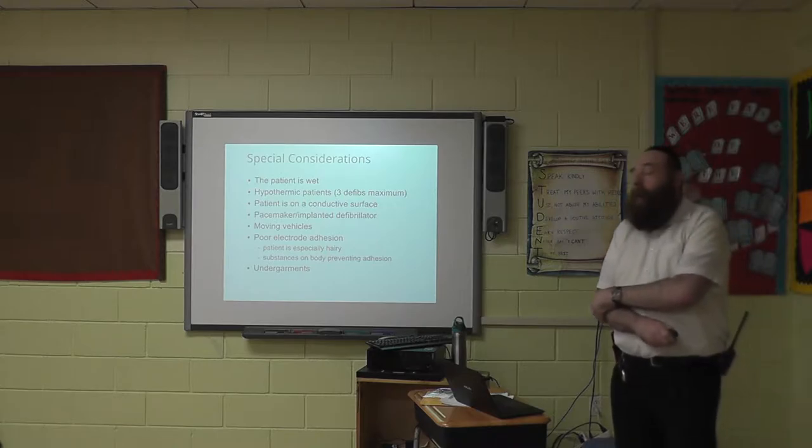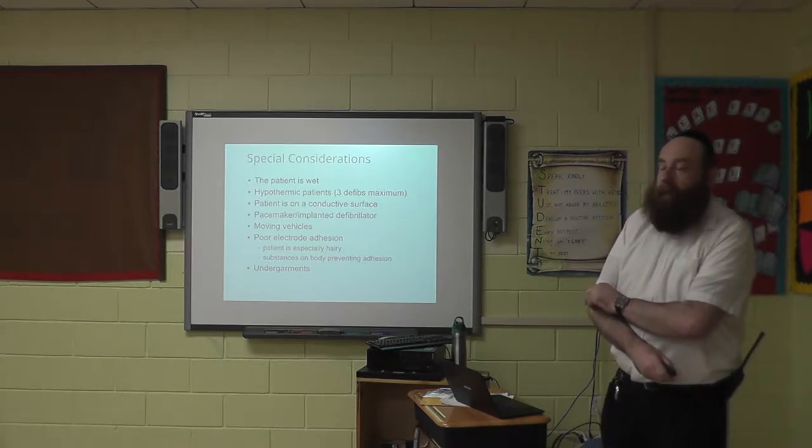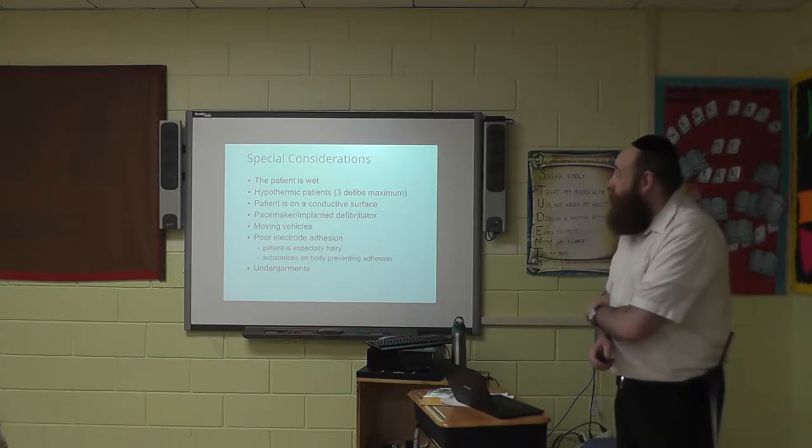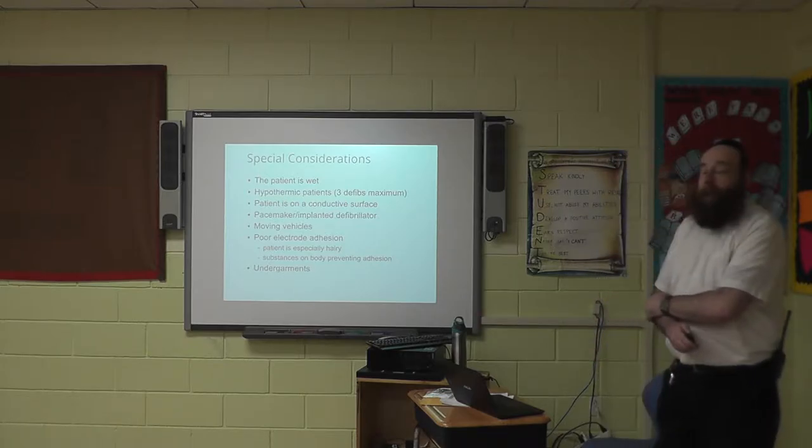Undergarments, obviously, all clothing. All clothing needs to be removed from the waist up. All clothing, undergarments, everything's got to go.